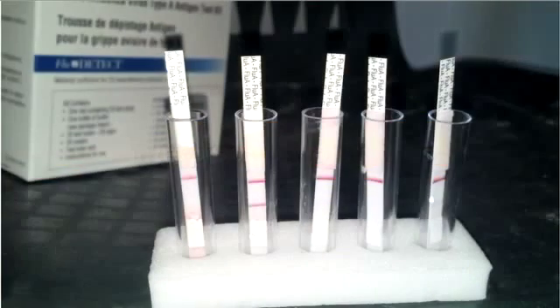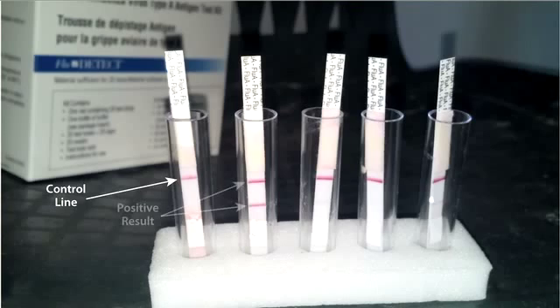The test is valid if the control line, pink-purple band, develops in the upper part of the test strip. The absence of the control line indicates that the test is invalid and must be repeated. A positive result for avian influenza type A virus is indicated when two pink-purple bands, a control line and a test line, are clearly visible on the test strip. This result indicates that detectable levels of influenza type A virus are present in the sample.